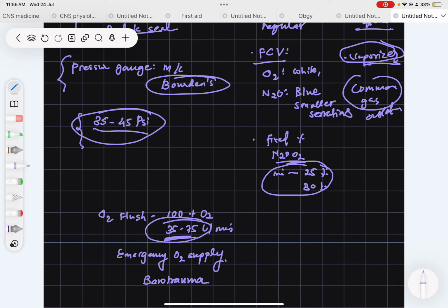So these three things are mainly included in anesthesia, and this is beneficial for patients who are going for surgery, for a better experience, less pain, and fewer post-operative side effects, and we can calmly do the surgery on the patient. So anesthesia is very helpful during the surgery, and we have discussed these three components in detail.